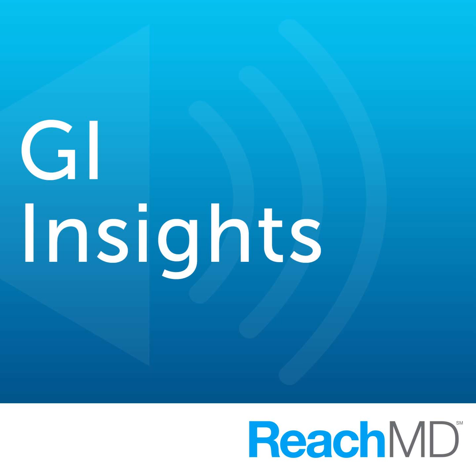Well, now that we've had a capsule endoscopy done on our patient, let's talk a little bit about managing the obscure bleeding. What can be done about small bowel bleeding that you visualized through the use of video capsule endoscopy? If you identify a lesion, generally we say if it is in the first 75% of the small bowel transit, that will go with an oral enteroscope. And once you identify the lesion with the enteroscope, then you have several options.